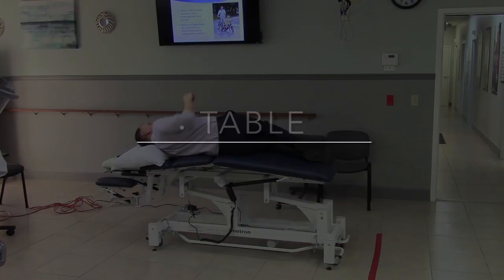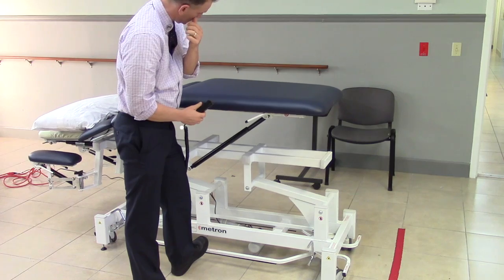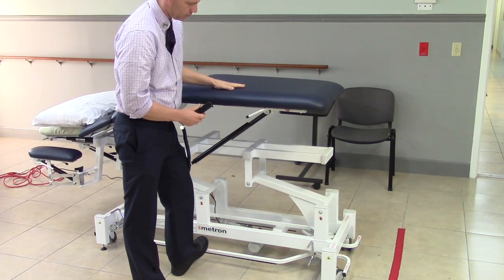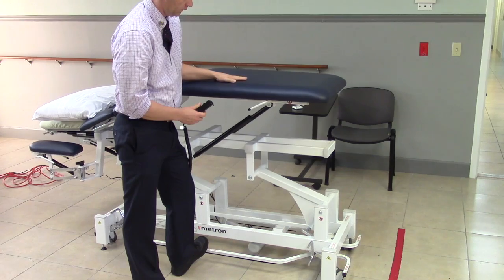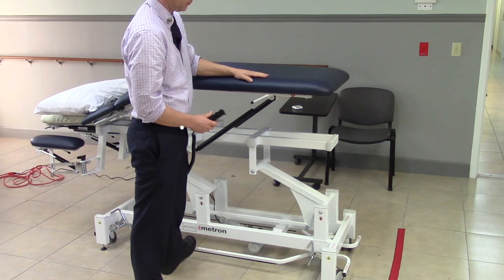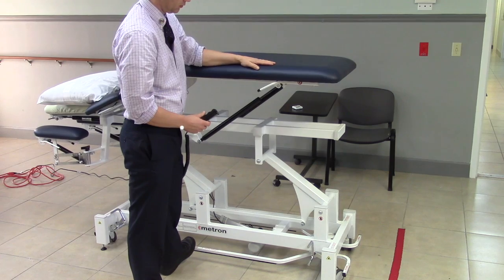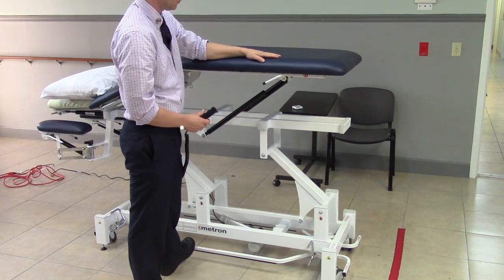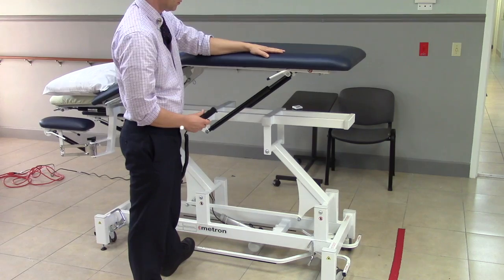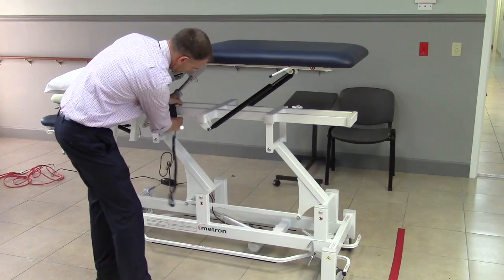Next we're going to look at how to maximally position the table. First, raise the midsection to its highest height, then push down on the bar and bring it up to the maximum position. You can be at up to chest height, useful for training patients in lifting and setting — simulating reaching into a cupboard or putting something on a shelf.